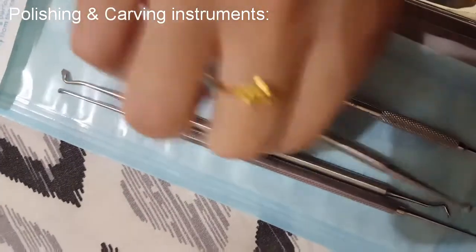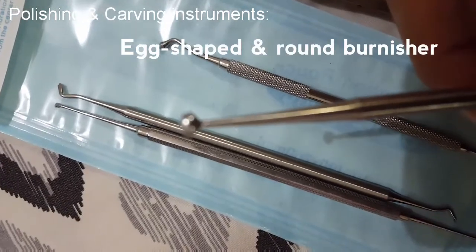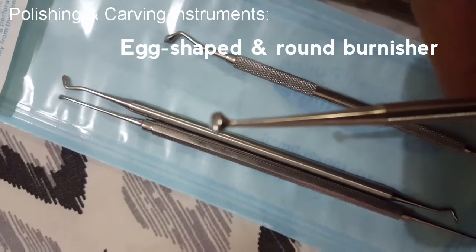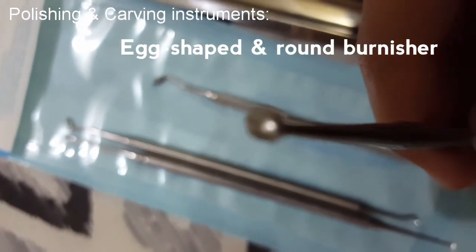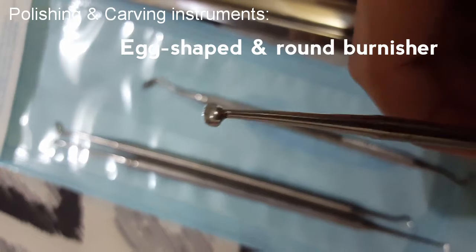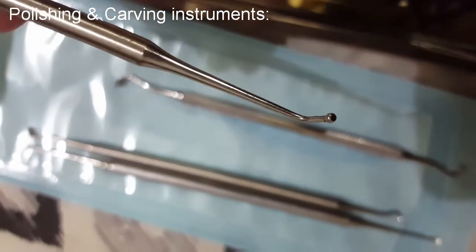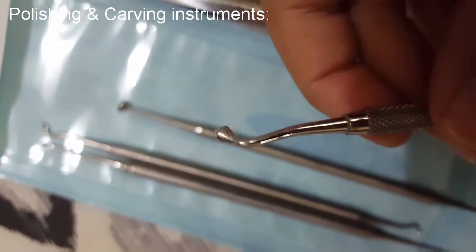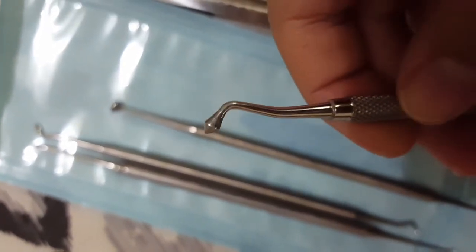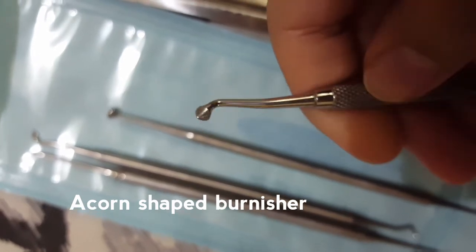Then we have the polishers, which is this is a burnisher. This is our burnisher. This side is the egg-shaped side, and this side is the round side. This is our acorn-shaped burnisher, similarly used for polishing the surface of the composite filling.